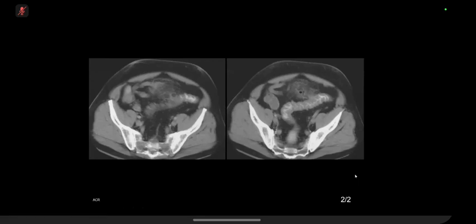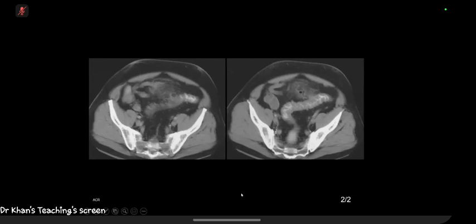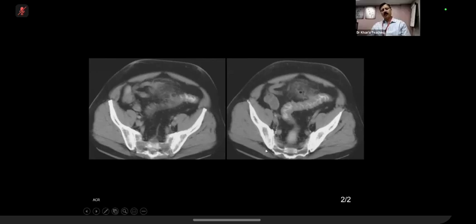I would check the rest of the CT to look for any other extraluminal gases. The patient needs to be referred to the general surgery urgently. So what will be the management for this kind of finding? They may choose to manage it conservatively with antibiotic if it's just a single locule, and see if it resolves conservatively. Okay, fine, good.